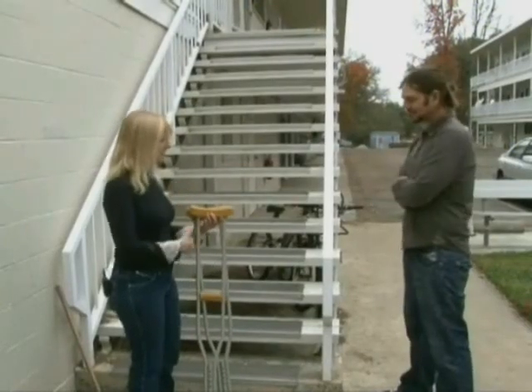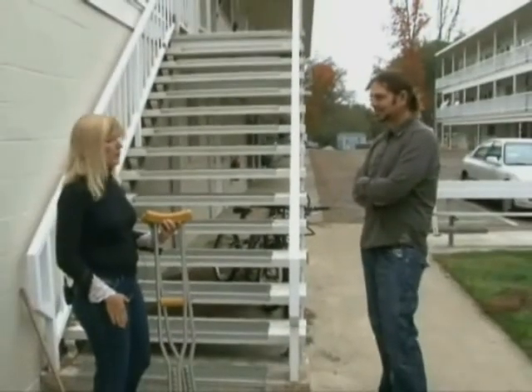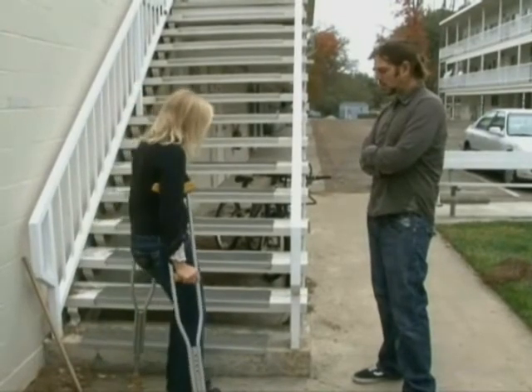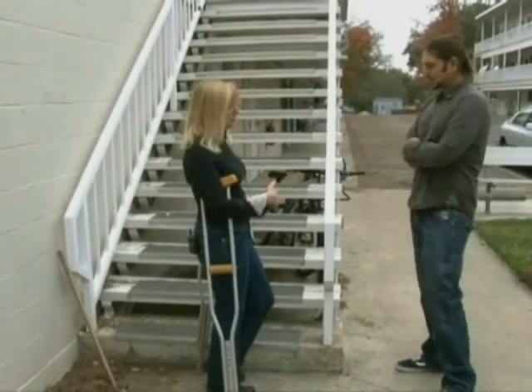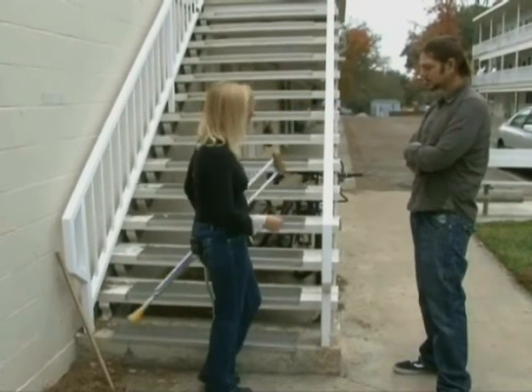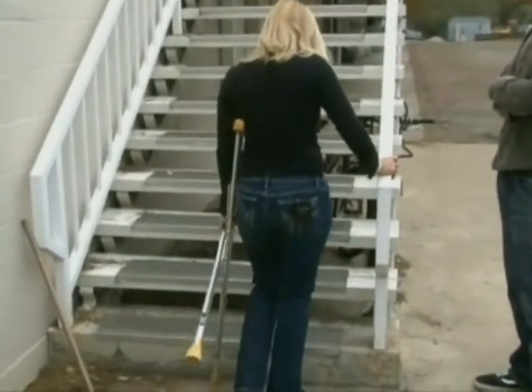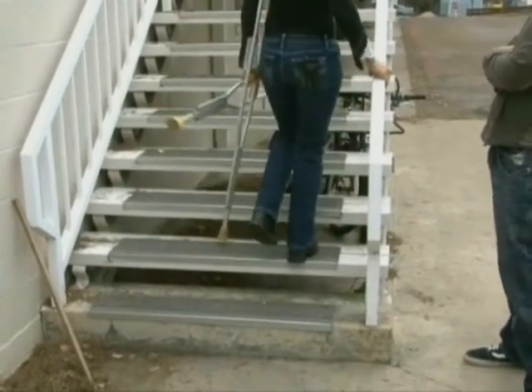Your left knee is bad — the doctor doesn't want you to put weight on that leg. Your weight will go on your right leg as well as the palms of your hands on your crutch and the handrail. Moving to the stairs: put your strong side to the rail, weak side on the left, right side on the handrail, both crutches on the weak side. Put your strong leg up first, follow with the weak leg and the crutch as a unit.